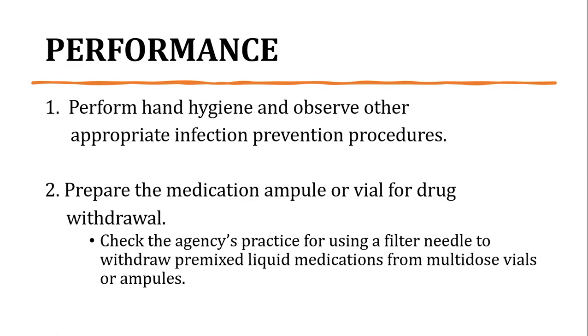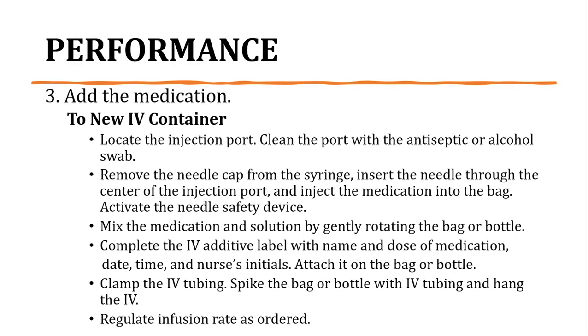Number 2 is to prepare the medication ampule or vial for drug withdrawal. Check the agency's practice for using a filter needle to withdraw pre-mixed liquid medications from multi-dose vials or ampules. Then, add the medication. Adding medication to new intravenous container.